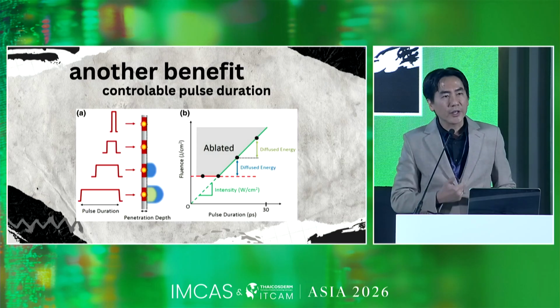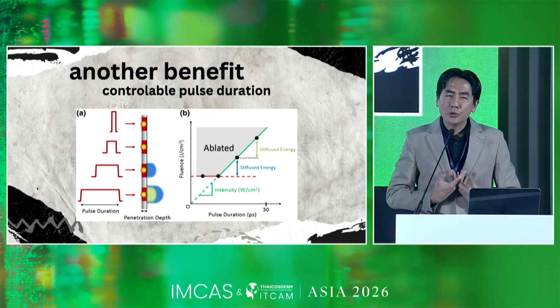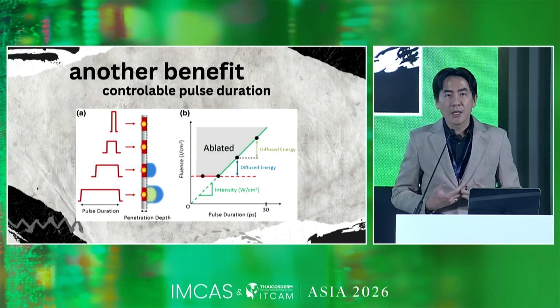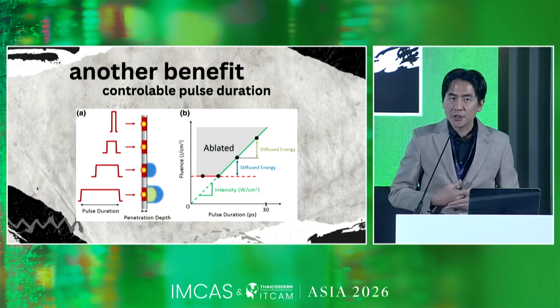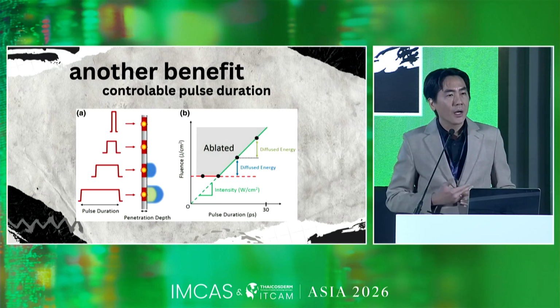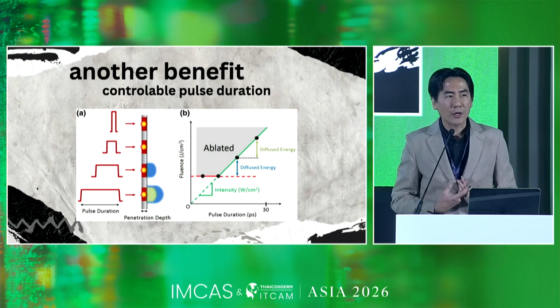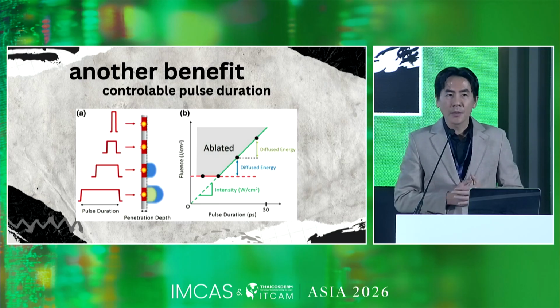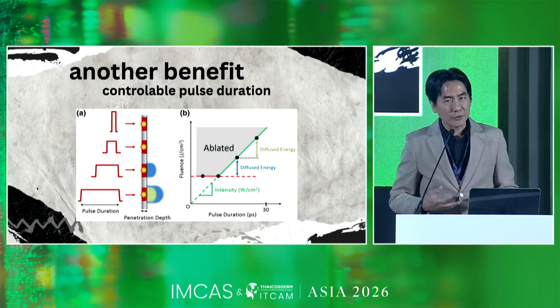How do I manipulate it? For example, if I want a shallower penetration with the thulium laser, just before the laser I mostly inject skin boosters to hydrate the superficial layers of the skin. You can use HA, or just sodium chloride, to infuse water into your skin. The thulium laser will penetrate shallower because it's sensitive to water.